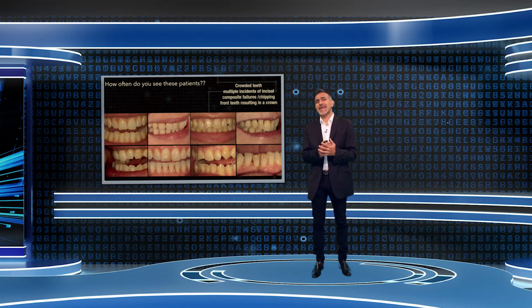What I'm going to say to you today is that actually these patients are screaming out for orthodontics. They need it, but a lot of the time we don't realize they do. So that's fundamentally the basis of what this lecture is going to be about, and how to use SureSmile Aligners to actually make this work for these particular patients.